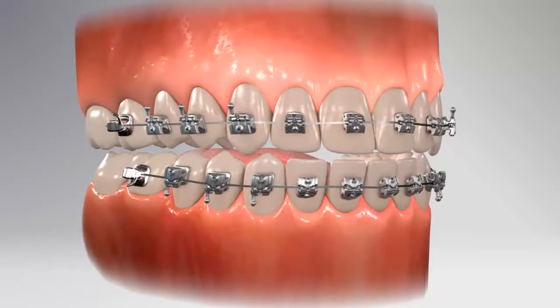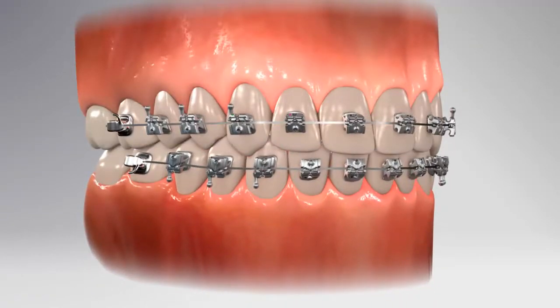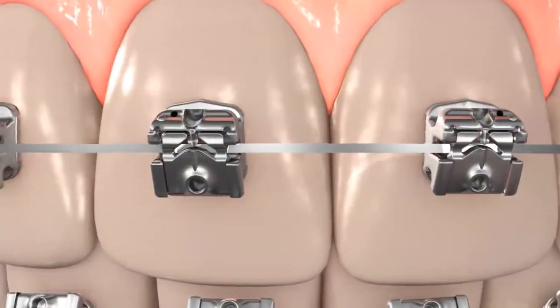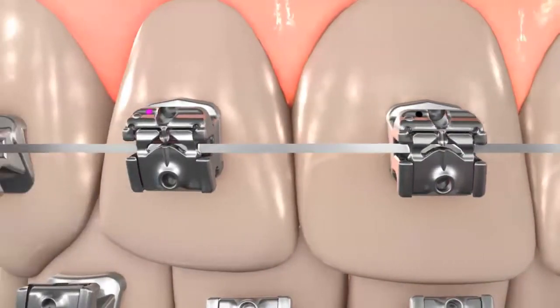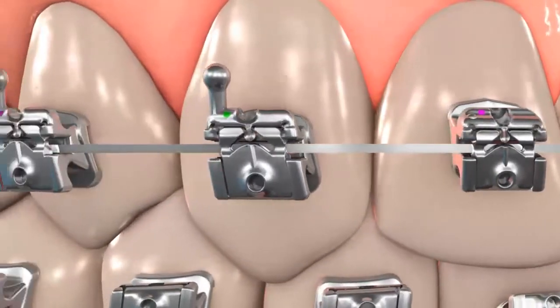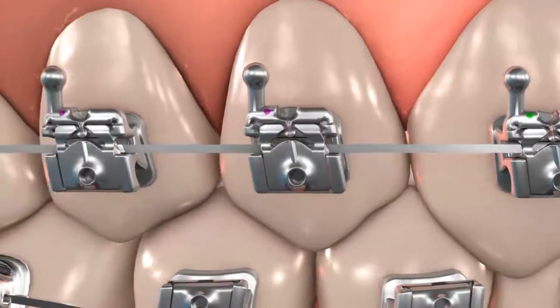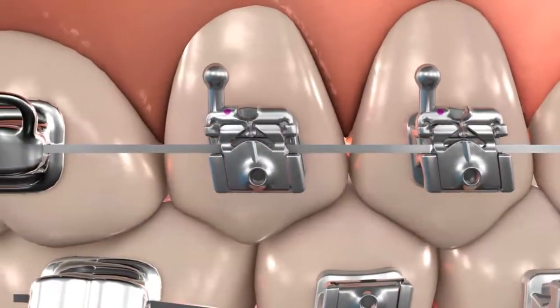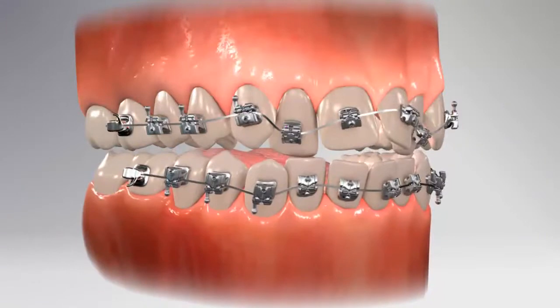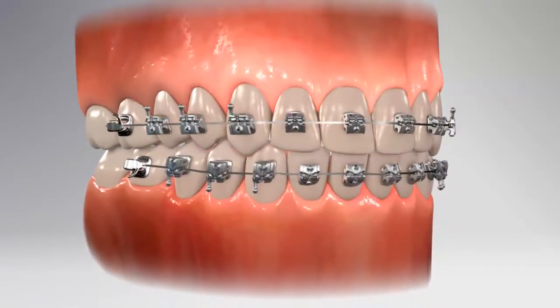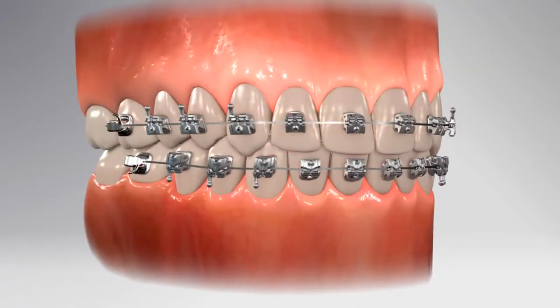Unlike the leading passive self-ligating brand, Carrier SLX brackets are tooth-size specific: larger brackets on larger teeth, smaller brackets on smaller teeth, a feature designed to ensure optimal rotational control and expression of the prescription, reducing the need for wire adjustments. The result of better control is faster and improved finishing.